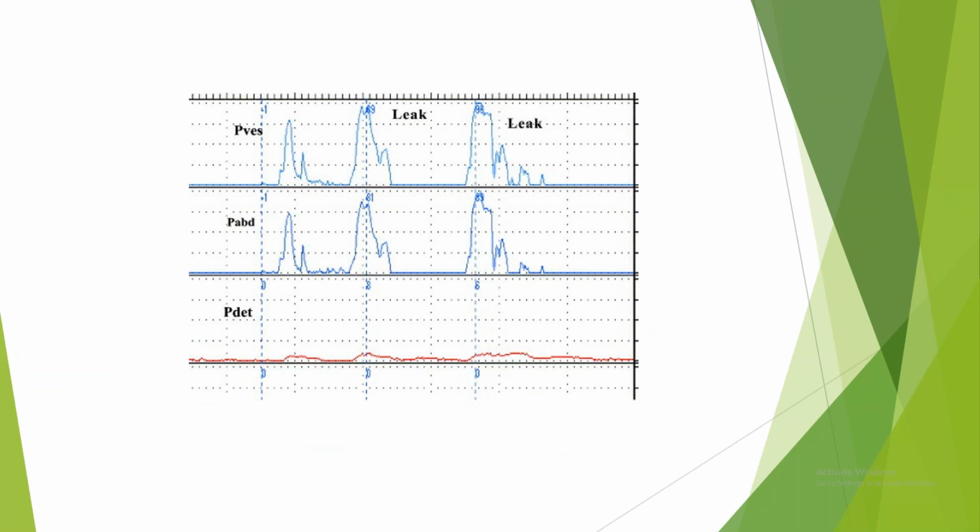See, again this is... Complete or incomplete? It is an incomplete graph. Voiding incomplete, but there is a leak. Yeah, there is a leak. The diagnosis is stress incontinence, urodynamic stress incontinence. Use the complete word. Yes, a urodynamic stress incontinence.